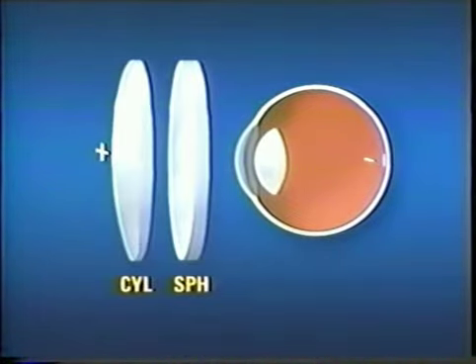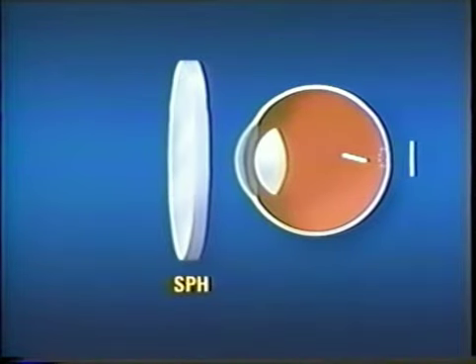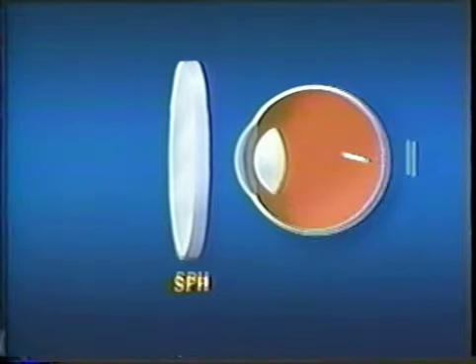The patient will thus be given an astigmatic correction, whatever it takes, to place the vertical focal line on the retina. This is a known artifact of cross-cylinder testing with letter charts, and is avoided by frequent adjustment of sphere to keep the circle of least confusion, or the point of best focus, on the retina prior to and during cross-cylinder testing. Those were the basics of astigmatism and cross-cylinder testing. We'll return to focal lines and to the circle of least confusion as we proceed through the steps of subjective refraction.